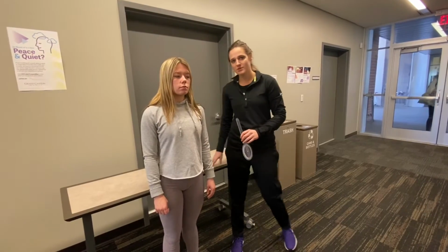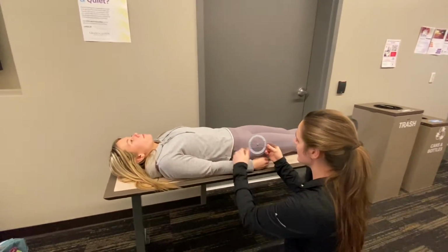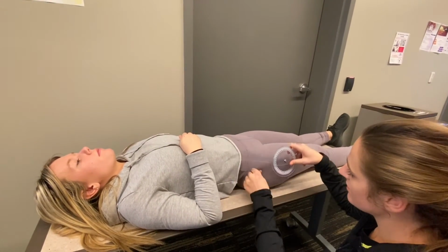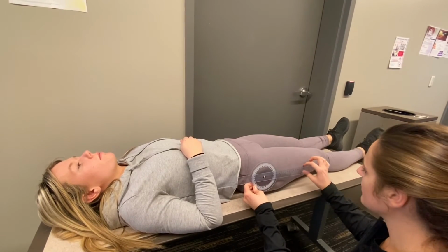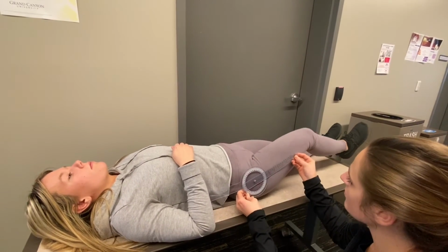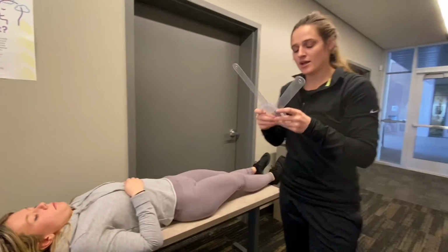I'm going to have my partner lie supine on the mat. We're going to go to the greater trochanter for the axis of rotation. I'm going to have you put your arm up. The stationary arm is going to be aligned with the midline of the pelvis, and the mobile arm is going to be aligned with the lateral epicondyle. When you're ready, go ahead and flex your knee and your hip. Great job. Report 119.